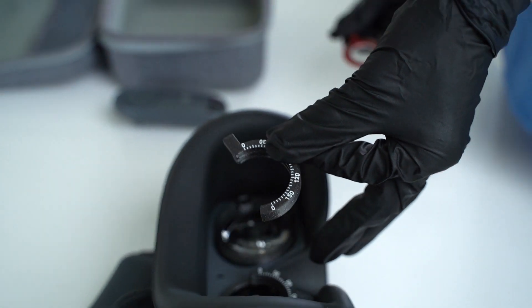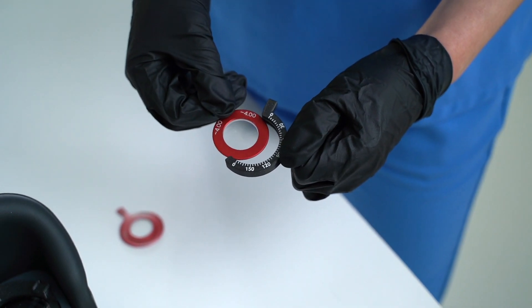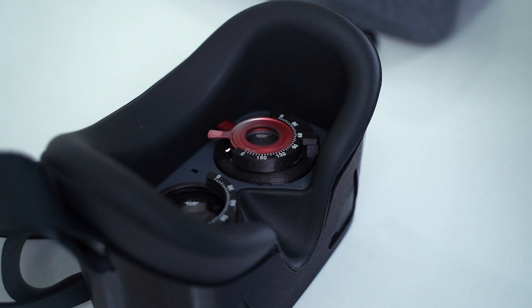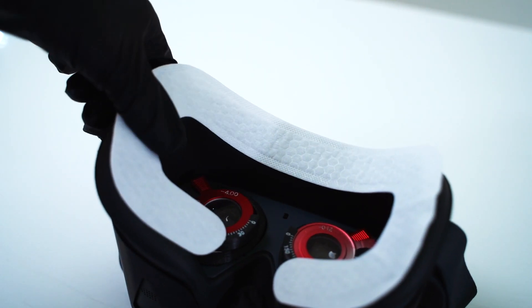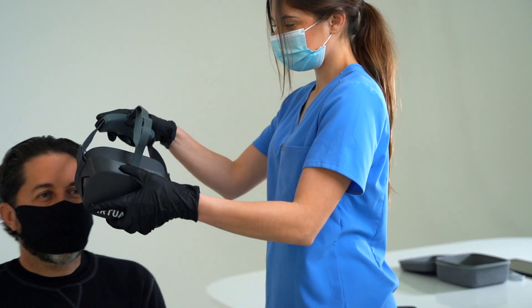Or even on the road. Trial lenses can be used to correct for refractive error. For patients with astigmatism, use our magic adapter to hold both cylinder and sphere. For cleanliness, the instrument can be wiped with alcohol and new hygiene covers installed at the beginning of each exam.